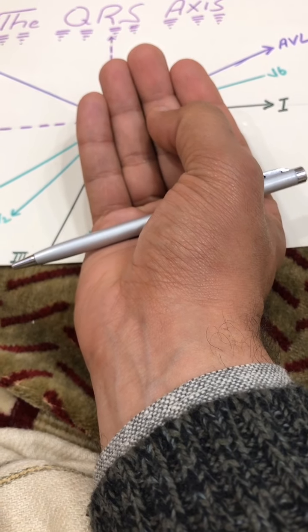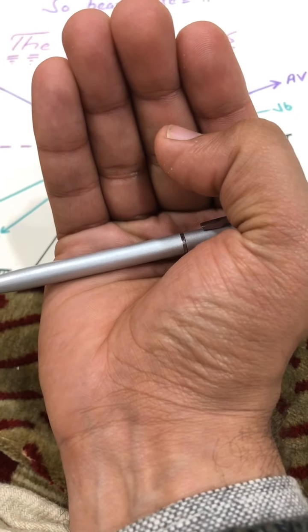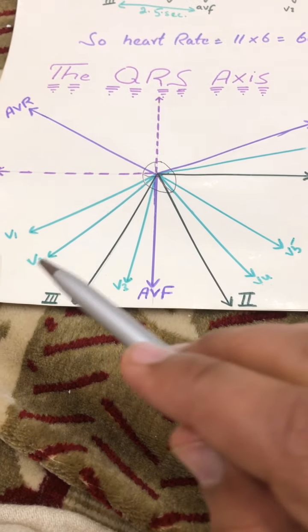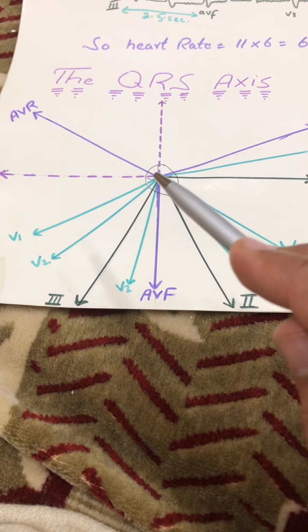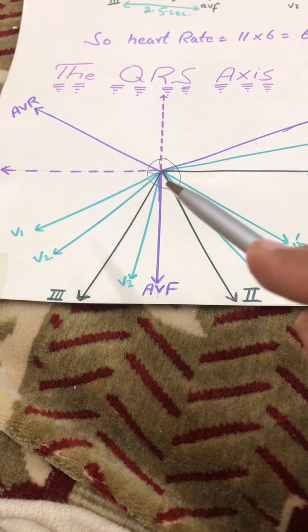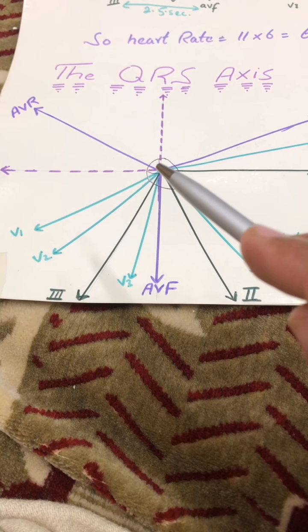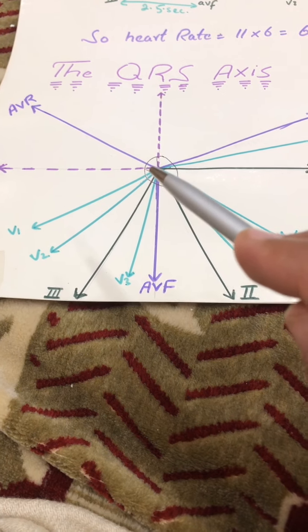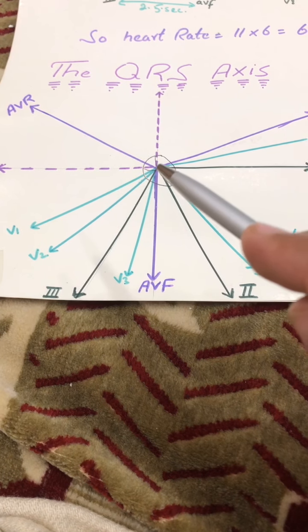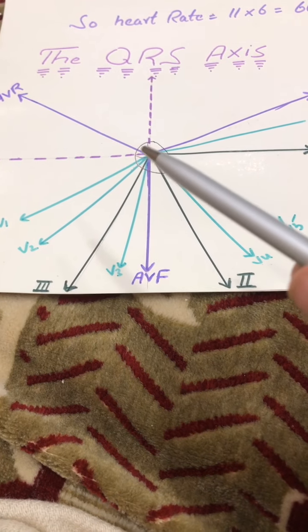If I make this person stand, it will be like this, anterior side. See, okay, V3 and V4, remember this thing. V1 and V2 are looking at the septum. See, interventricular septum. I have drawn this heart a little bit down, but I would have drawn it a little bit above. It is because of my drawing, but V1 and V2 are going to look at the interventricular septum and the atria. See, the atria.